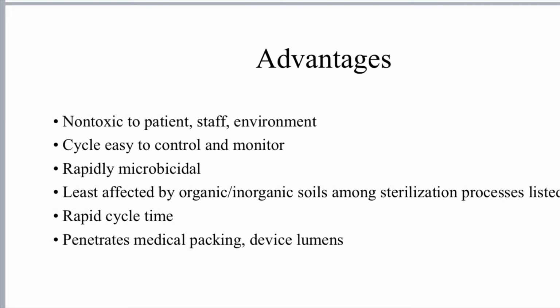Advantages: non-toxic to the patient, staff, and environment. Cycle easy to control and monitor. Rapidly microbicidal. Least affected by organic and inorganic soils among sterilization processes listed. Rapid cycle time. Penetrates medical packaging and device lumens.